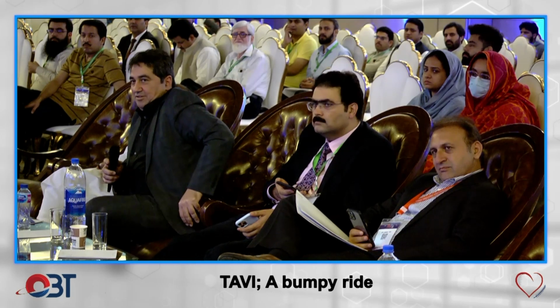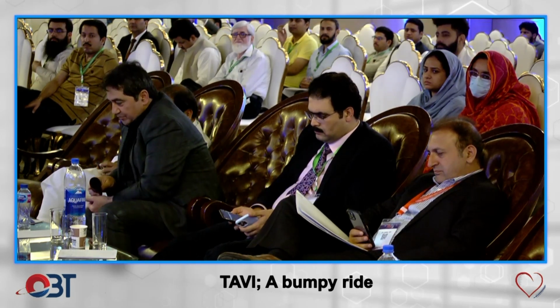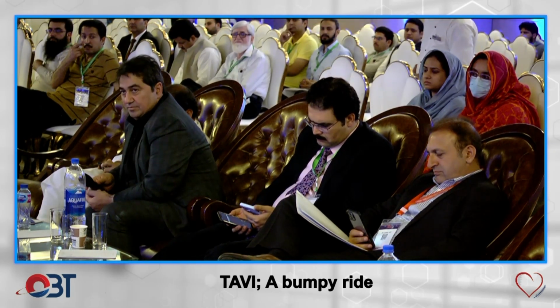I don't think it is obsolete, because this is one of the best methods. From the calcium score, you can find out about the severity of the aortic stenosis.